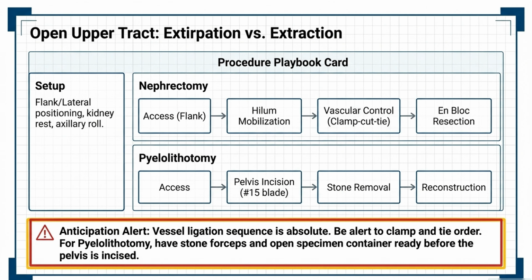This slide compares a nephrectomy and a pyelolithotomy workflow. Nephrectomy involves access, hilum control, and full organ removal, while your pyelolithotomy focuses on stone extraction and reconstruction. Proper positioning and setup are essential for both. Anticipating vessel ligation and having instruments ready is critical for safety.